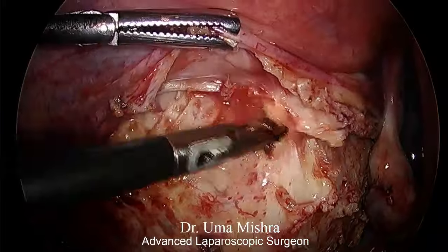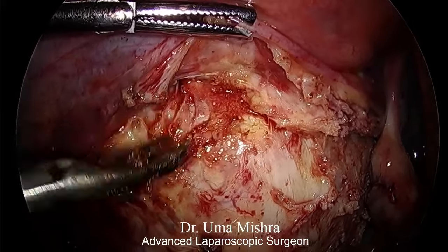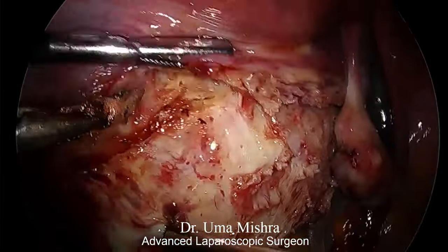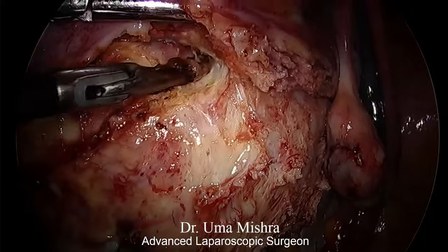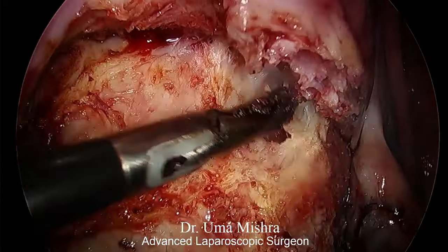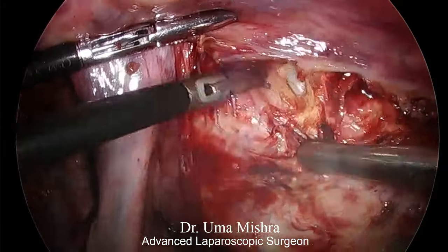So we apply myoma screw at different positions and provide traction and counter traction, and then we excise the myoma. Here I am excising myoma with the help of shearer. The benefit of that is we can manage some bleeder once we come across. So till now I have faced hardly any bleeding over here.